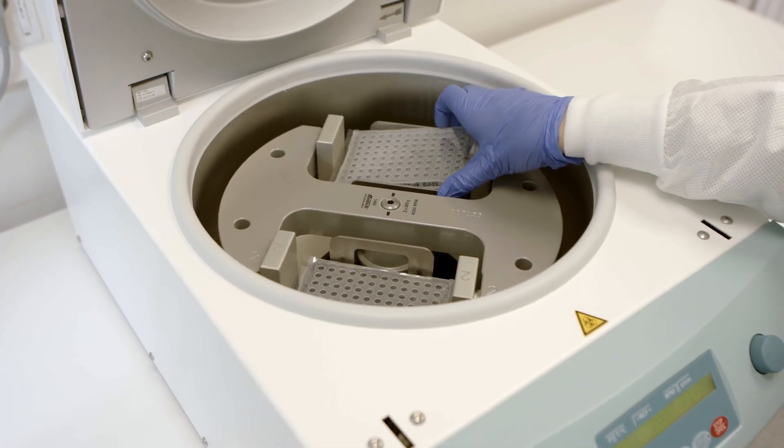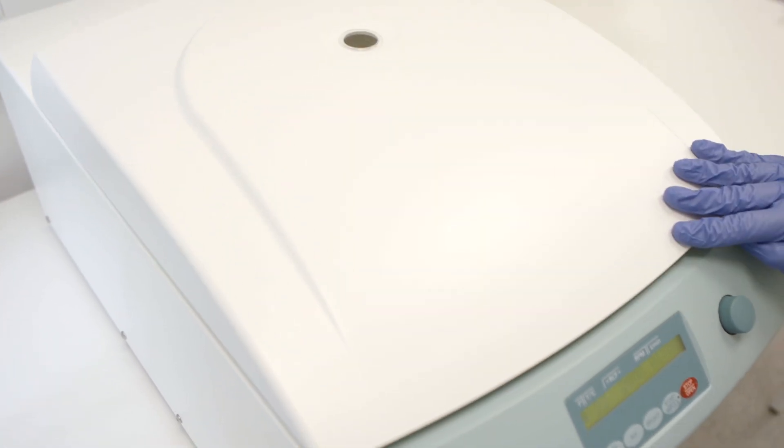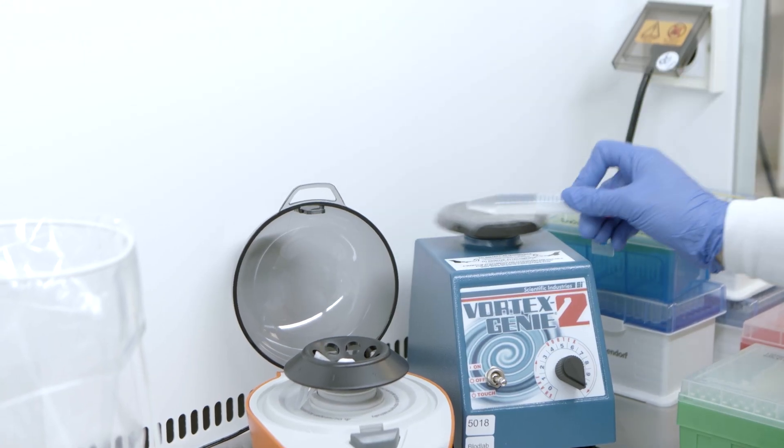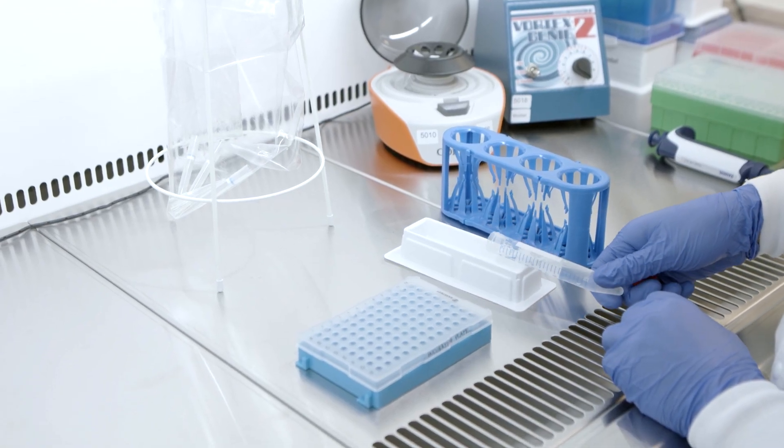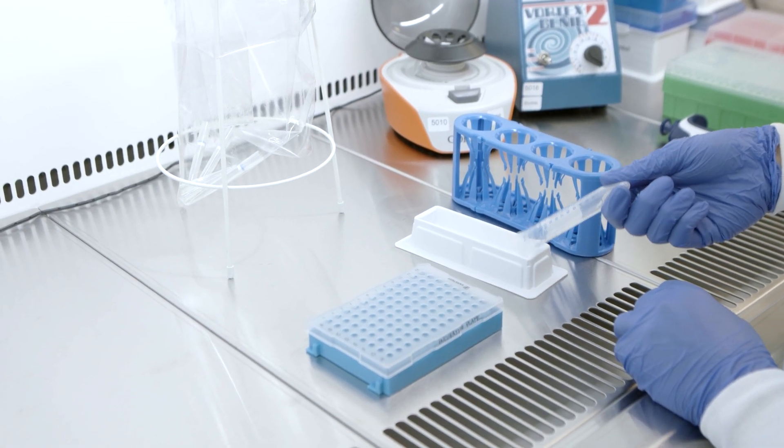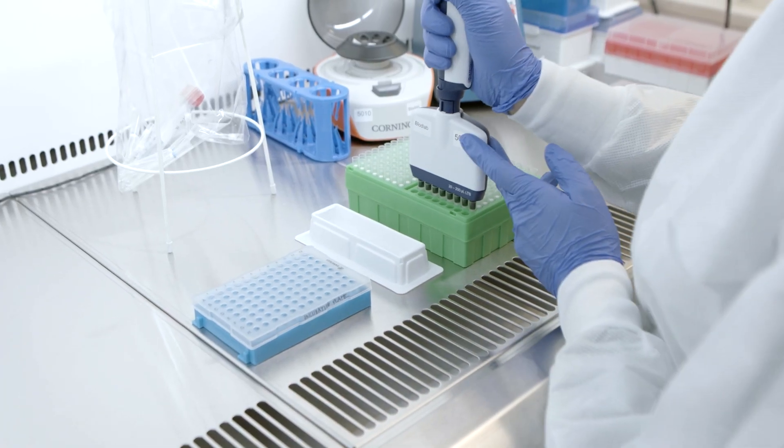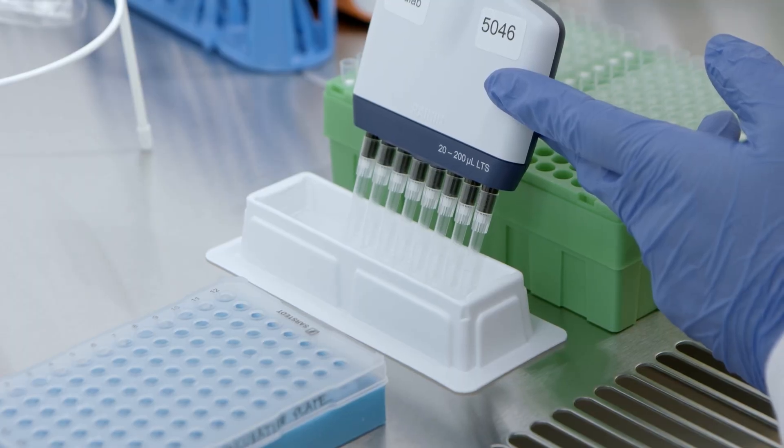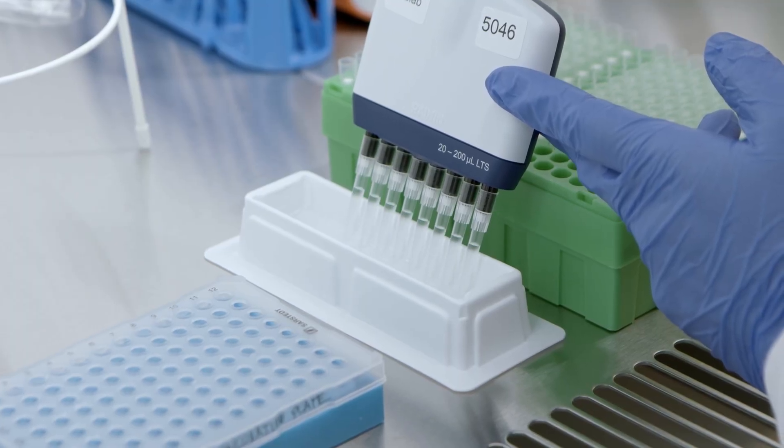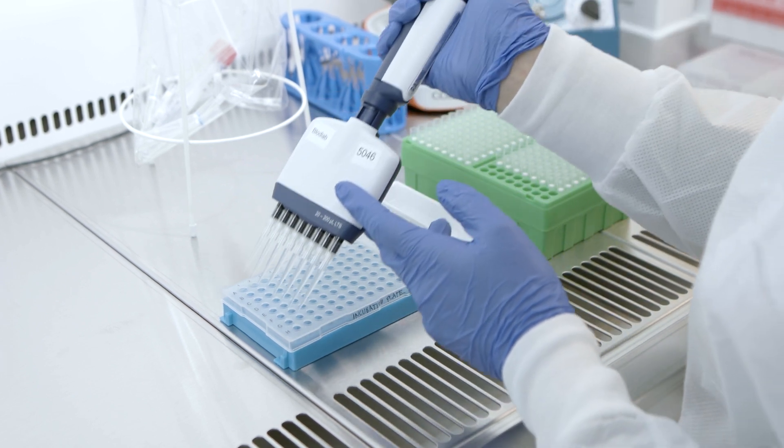Spin down the incubation plate and carefully remove the adhesive film. Vortex the extension mix and pour into a multi-channel pipette reservoir. Precondition 200 microliter multi-channel pipette tips using extension mix before proceeding. Use the same pipette tips for the entire plate.